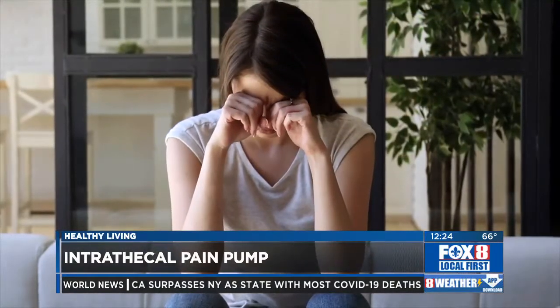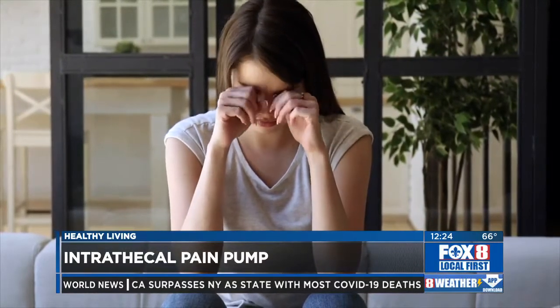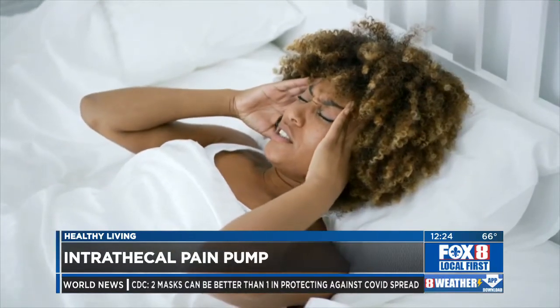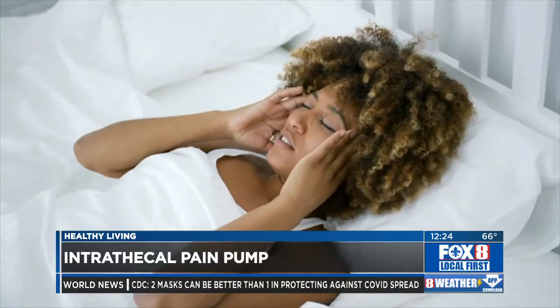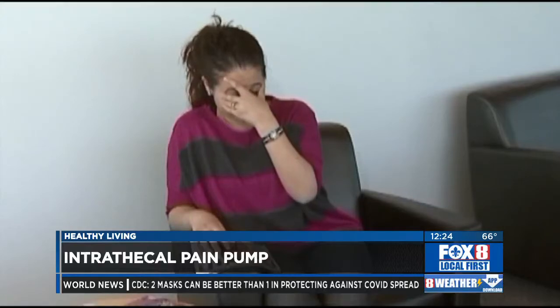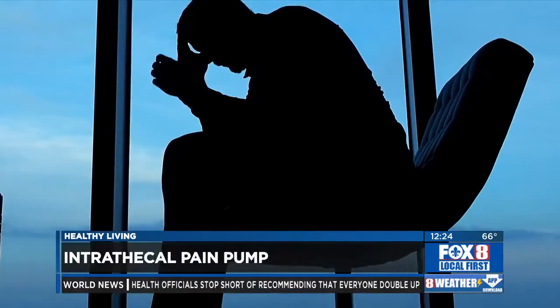Yeah, we put these in for people exactly just like that. Again, go to the pacemaker analogy. You get a pacemaker because your heart has failed to that level. But these patients are married to me. This is something that I sit with patients because this is not a put it in, forget about it. They still have to come see me every 2 months. We have to fill the pump. We have to maintain it, change the medicines. There could be complications. The catheters can break. The pumps can flip. So this is a device that you really need to have a good relationship with your physician, because it isn't just a put it in, forget about it. There's a lot that goes involved with it.